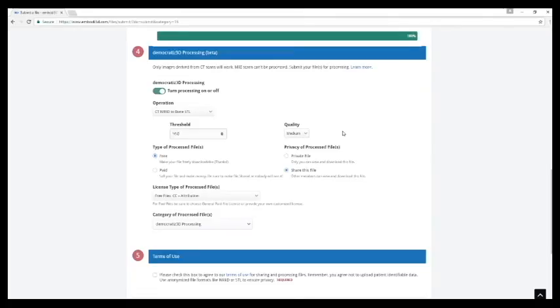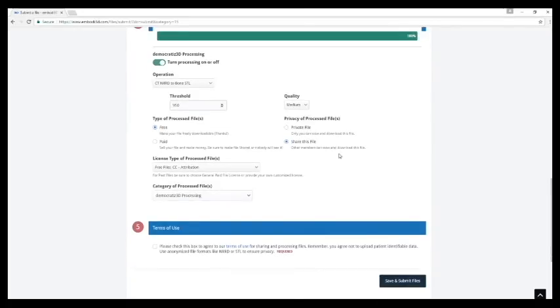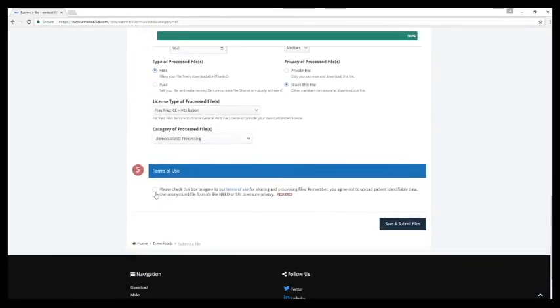Quality medium is OK. And then we are just going to agree, save and submit the files.